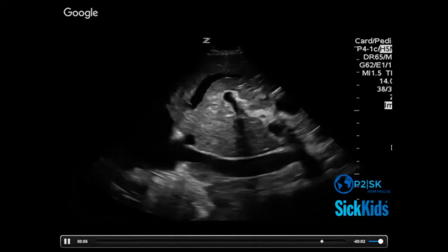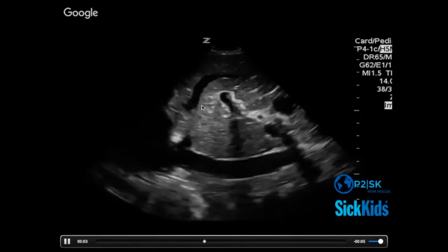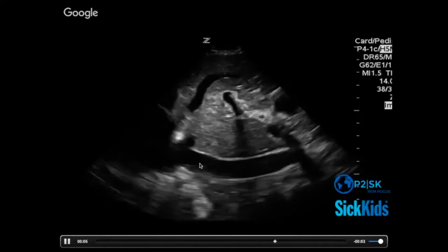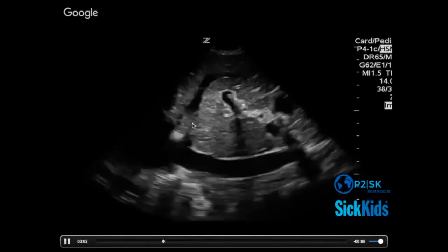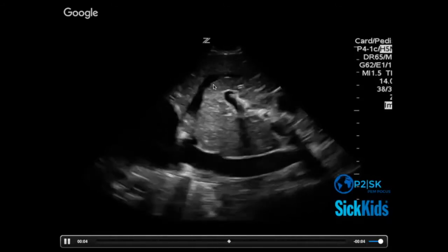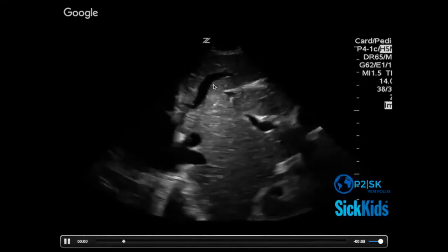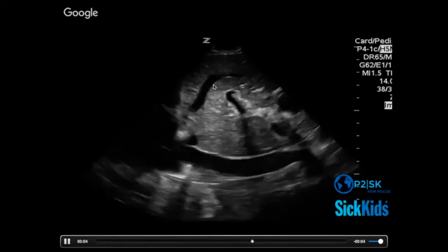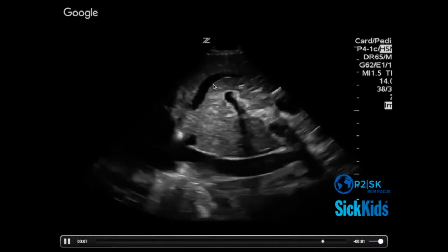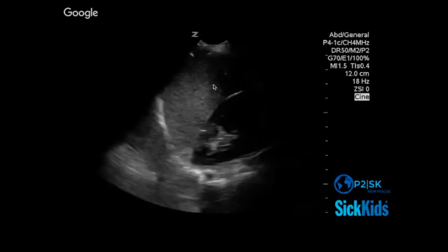Yeah, very plethoric IVC with, yeah, one of those features that when things really do get backed up and you've got a high CVP, you'll see the hepatic vein get very dilated and act like a big wedge within the liver. And this makes sense, right? My problem is my left side is not pumping, so everything back in the circuit is going to be dilated.